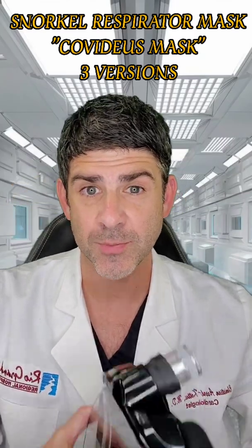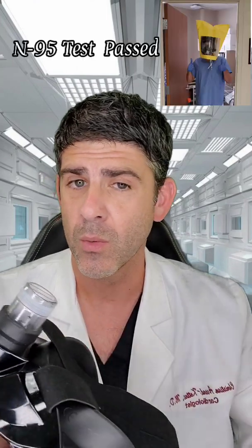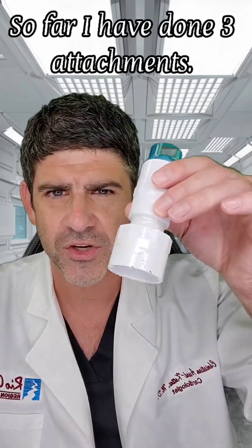I recently came up with an attachment for the Gear Ever G2 snorkel mask to turn it into a respirator with N95 — maybe even greater capacity. I tested it, it works fine, and this was the first attachment I came up with.